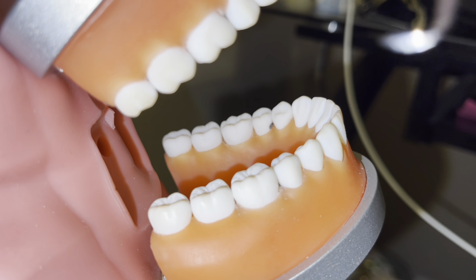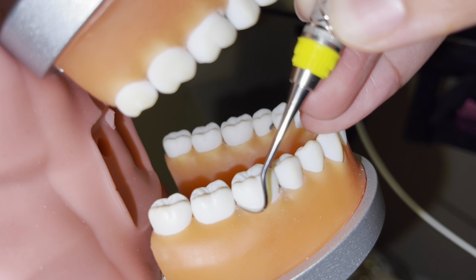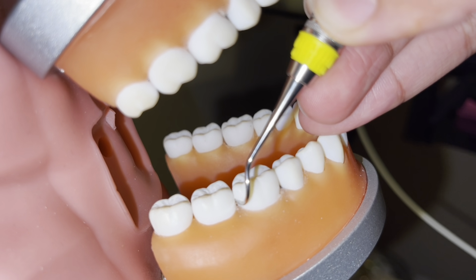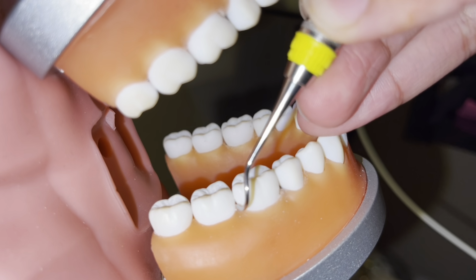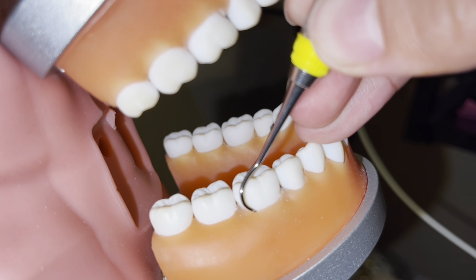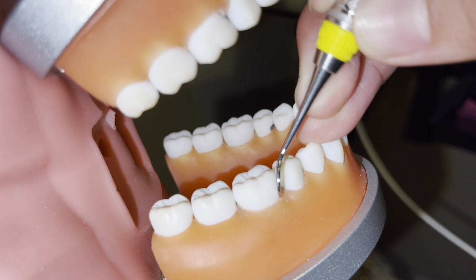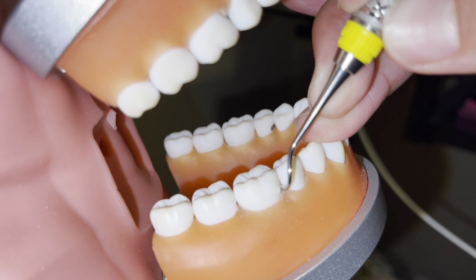So I want to start at the distal buccal line angle and activate an oblique stroke towards the distal, side to side, pivot roll, side to side, up, down. Turning the instrument halfway, we're going to walk across the facial aspect, maintaining tip adaptation, with oblique strokes, side to side, pivot roll, side to side, in the interproximal, up, down.